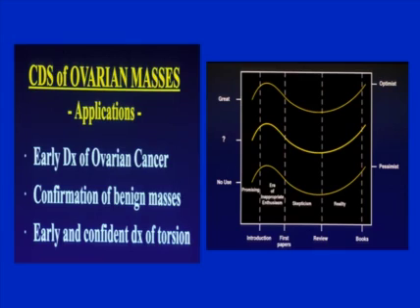Now, in any new technology, it seems that there's an early part where it's great, 95% accurate, etc. And then there's an era of what I call inappropriate enthusiasm, where it's used for everything, and then an era of skepticism where we can understand it has some limitations, and then finally in reality it finds what its particular niche is in the clinical world.